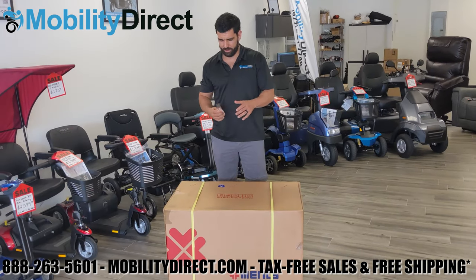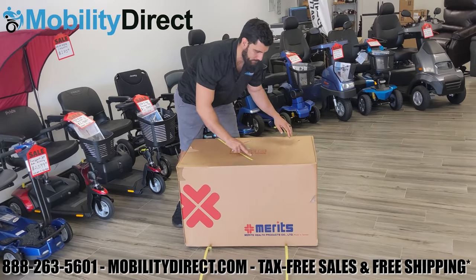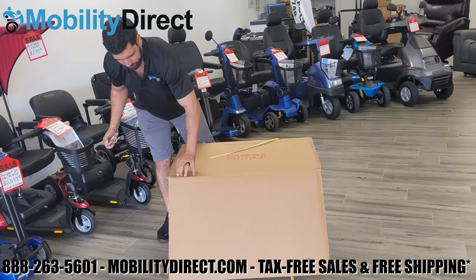When you order this power wheelchair, you will receive it on a pallet with pallet straps. You'll want to cut those with a box cutter, open the lid, and be careful with the staples on the lid — they are sharp.